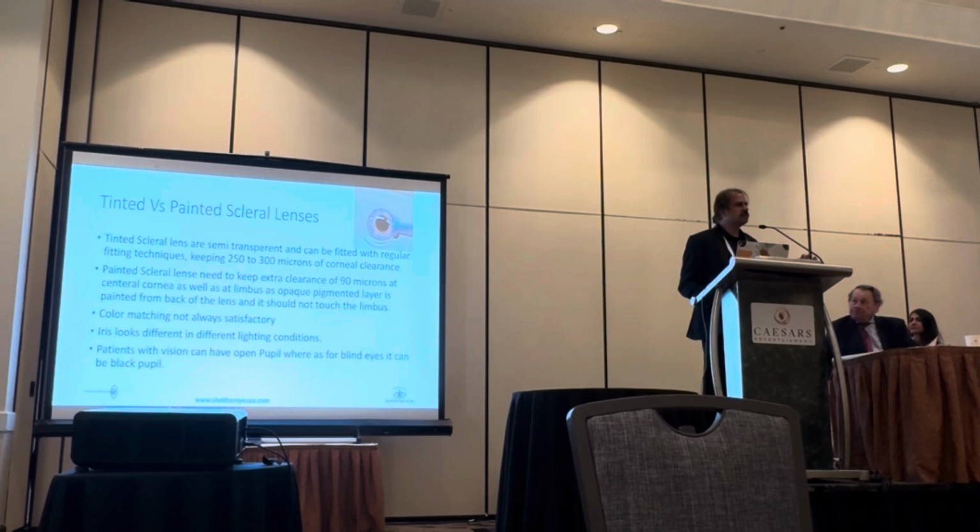Previously, when I was studying in the Moorfields Eye Hospital, London, they used to do an acrylic coating. The moment you do a coating, the oxygen permeability is lost. Here we are trying to maintain the oxygen permeability. Of course, it is reduced once you infuse these pigments into the matrix, almost 30%. I got it tested from certain labs, and it does reduce.